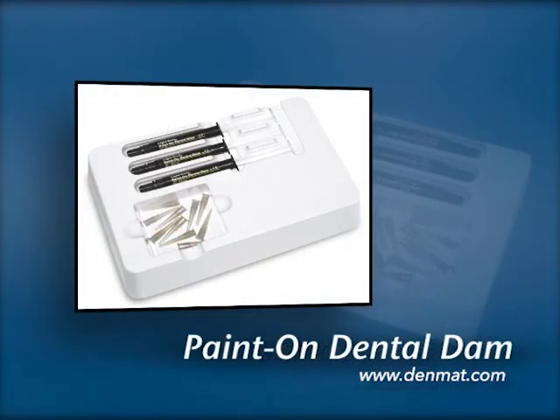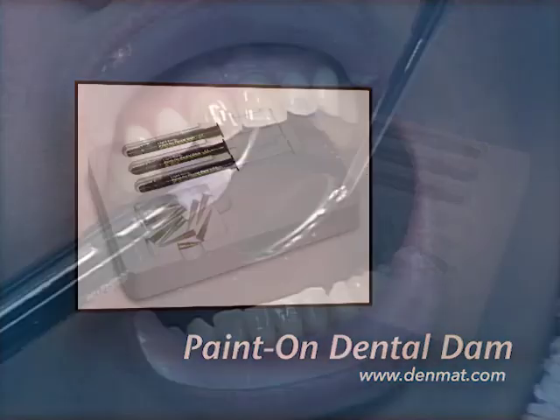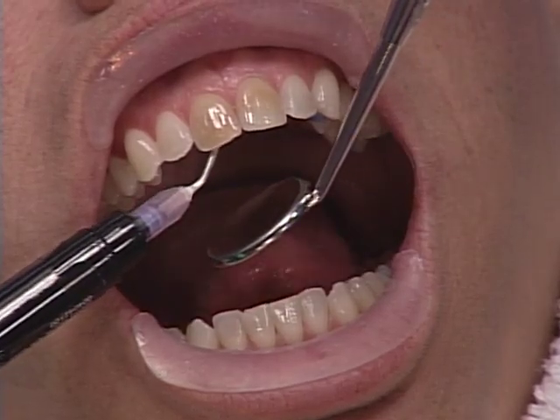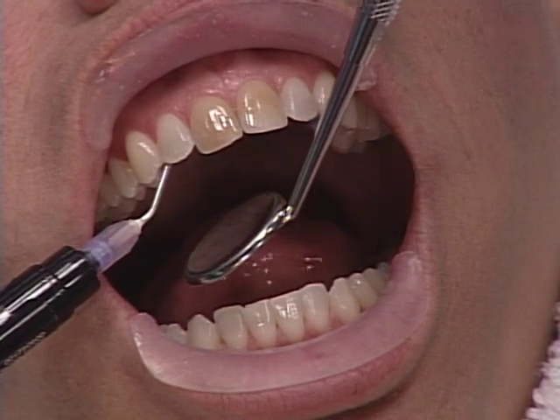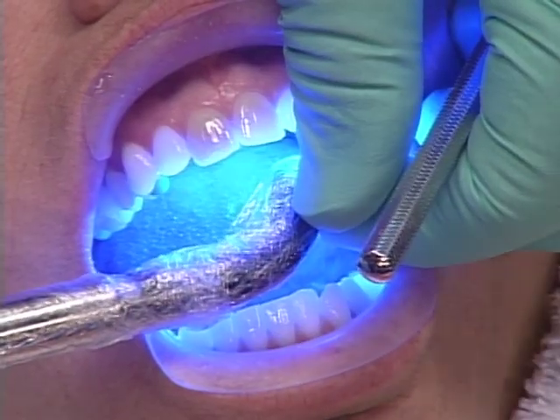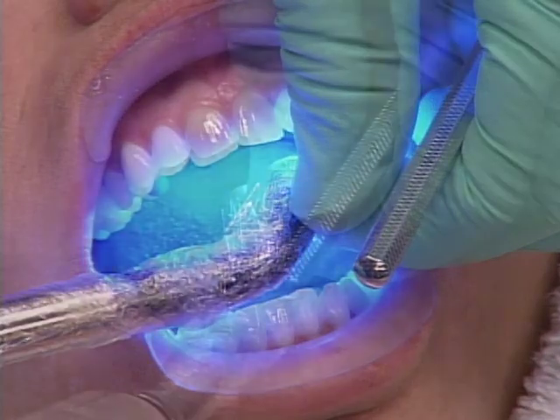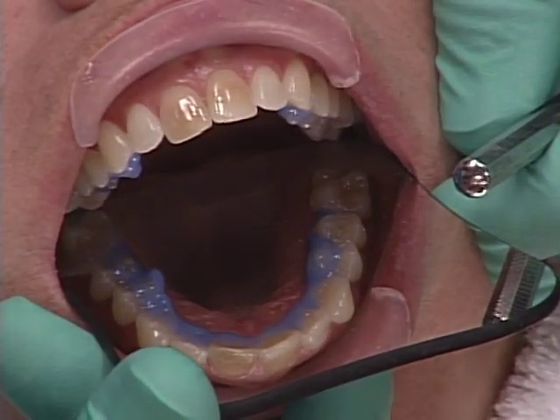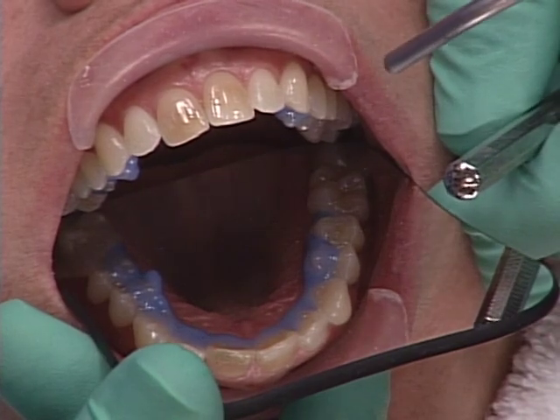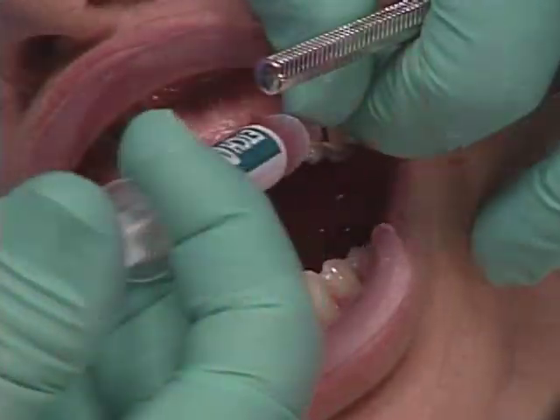Now I'm going to put some paint on dental dam on the lingual side, and every place I put paint on dental dam, I'm using the blue. Ultra Bond won't be able to bond to it. And we take a 3-second burst, and I keep the light about an inch from the surface. Close your eyes. And see how that blue is all around the lingual side? So when we start cleaning up, you'll see that'll make quite a difference.